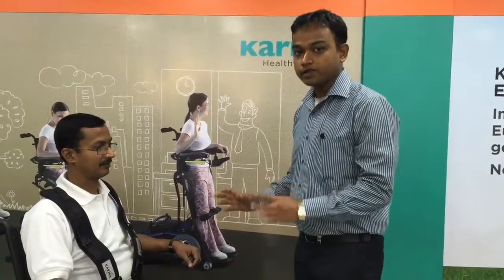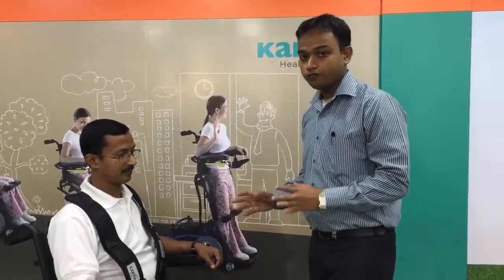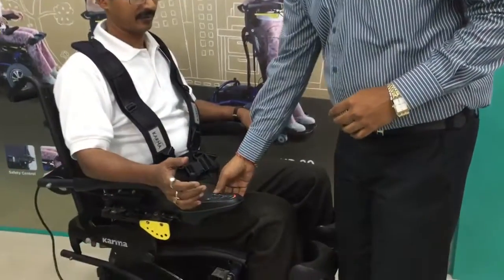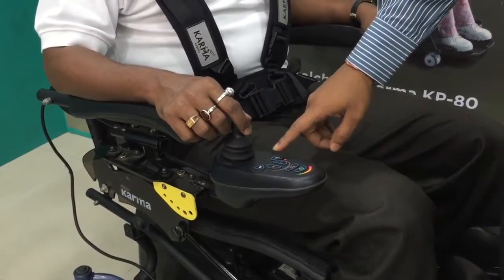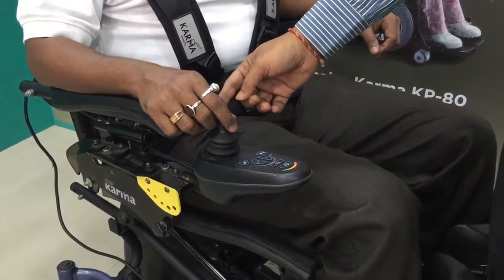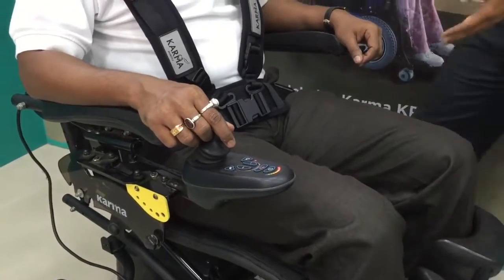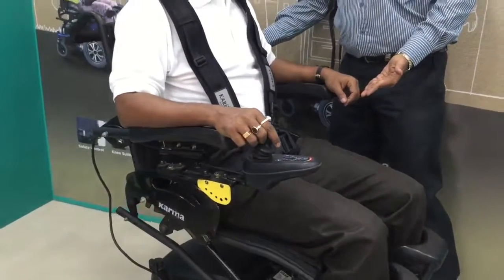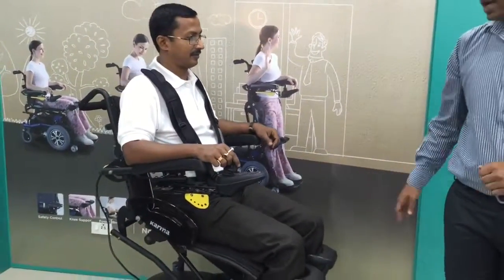Now we are coming to the main part of the KP80 demonstration. The KP80 is a standing power wheelchair, and we are showing how it works. You turn on the joystick and press the standing button, then move the joystick knob forward to go from sitting to standing. You can see the wheelchair frame rising slowly, bringing the user up from the sitting position to the standing position.